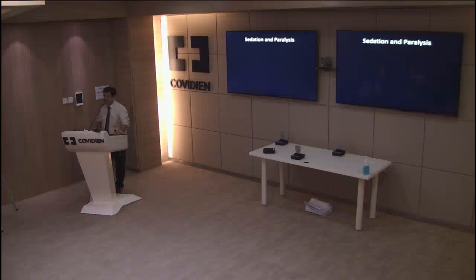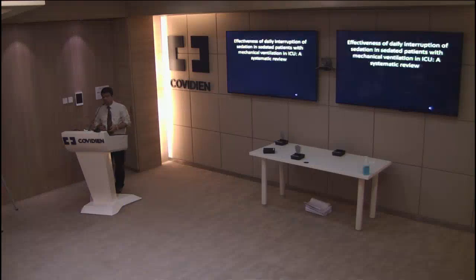Sedation and paralysis practices. Okay, now why did I term it in the strategies to reduce VAP? Obviously, anything which you do which will help the patient to wean off the ventilator very quickly will actually reduce your incidence of VAP. Okay, so your sedation and paralysis practices matter a lot. Though it matters for effective mechanical ventilation as well, it also matters to the point that it may eventually help you in weaning the patient off the ventilator.